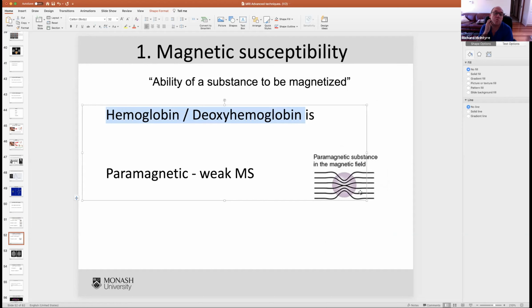And what we know is that when the magnetic field is disturbed, we get a decrease in T2 star. Okay, which means that we've got a magnetic field that's homogeneous, then it gets disturbed, all those spins are flipping, they're not dephasing and then rephasing together as they normally should. They're dephasing more because the field isn't homogeneous. Some in that area are experiencing a weaker field, the ones next to it a stronger field. Eventually they're not going to rephase properly like they would in a uniform magnetic field.